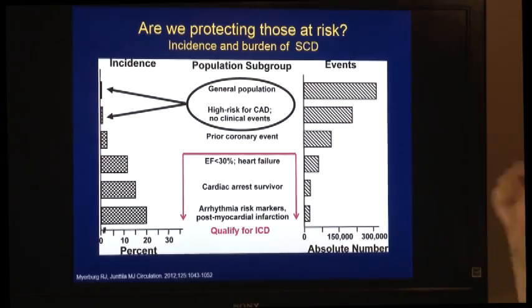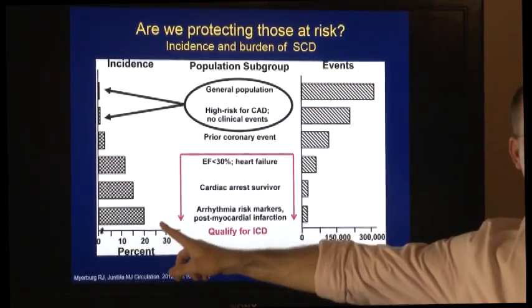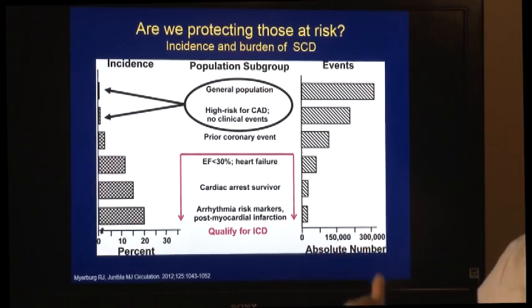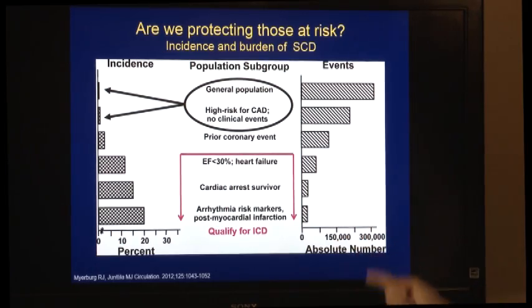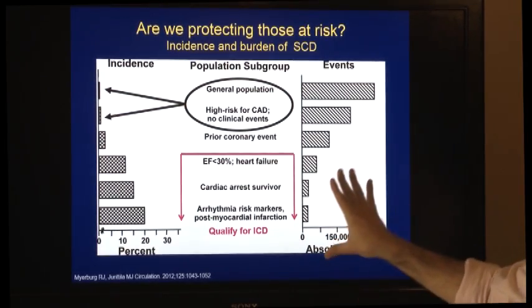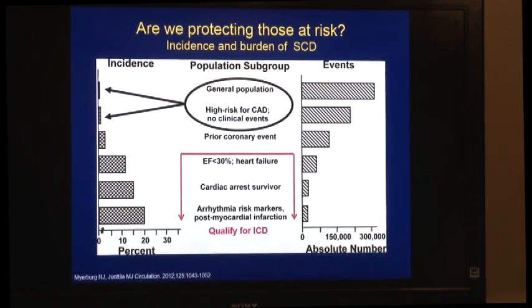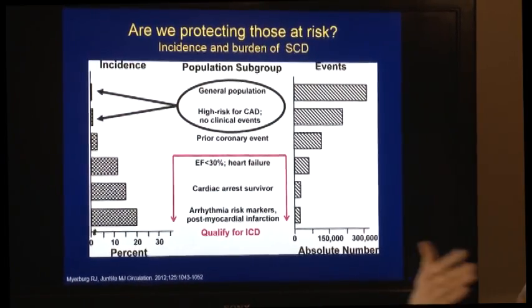As the coronary disease gets severe and your ejection fraction starts to drop, then your percent risk for having an event goes up dramatically, and we start to get into criteria for implantable defibrillators. But we have to appreciate that only a minority of the overall sudden cardiac death events in the country is going to be in that very high risk population. They're truly at risk, but by protecting that cohort of the population, we are only protecting a minority of patients who actually have the arrhythmic event, which tells us we absolutely have to cover that segment of the population with defibrillator protection, because their risk is exceedingly high, recognizing that we're going to miss the vast majority of people.